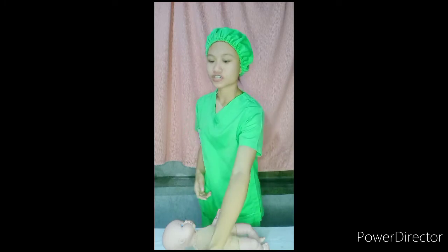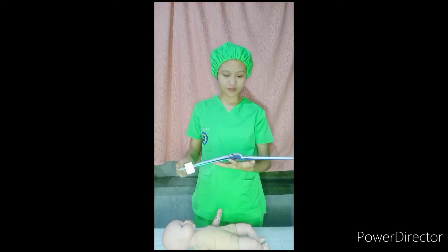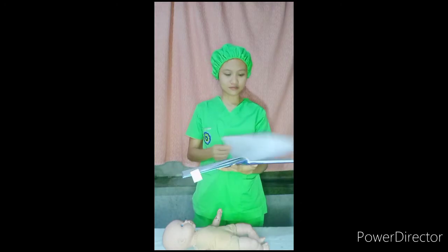Good morning, ma'am. I am Mabel Martin, registered nurse for today, and I am here to administer medication through subcutaneous injection. First is gather all materials needed, then check medication order against the physician's order according to agency policy, then clarify any inconsistencies and check the patient's chart for allergies.